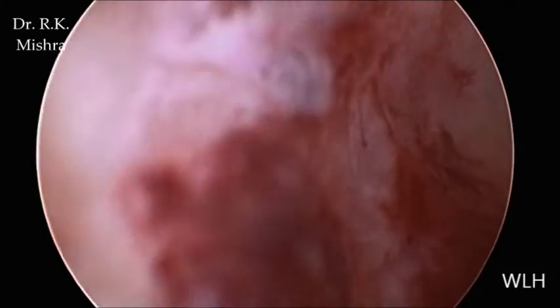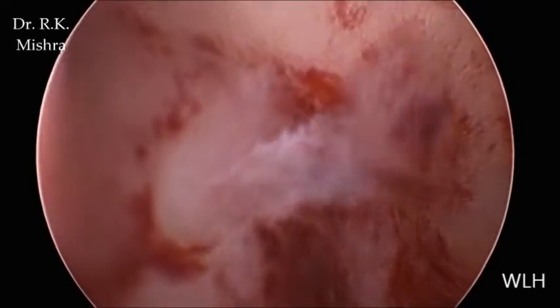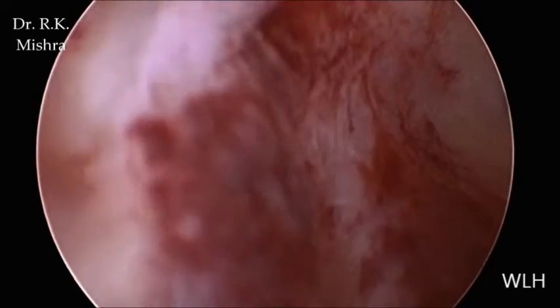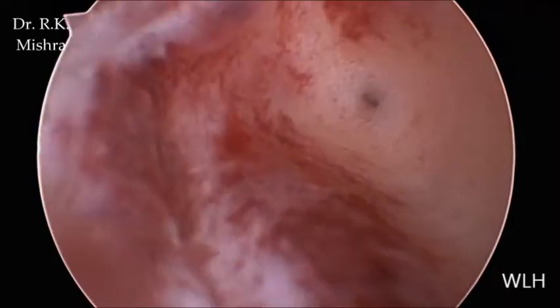Good morning. This is a case of simple diagnostic hysteroscopy. Here we are introducing the hysteroscope, and the pressure used is 180 mmHg with the help of a Medex pump. Now at 1 o'clock we are seeing the ostia.